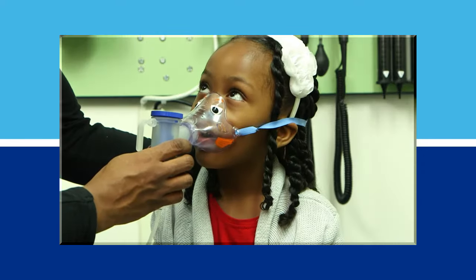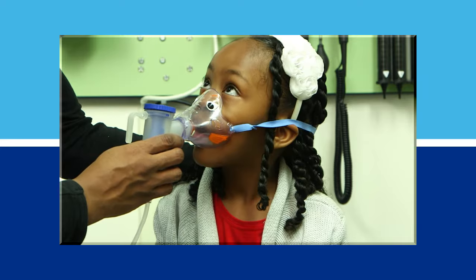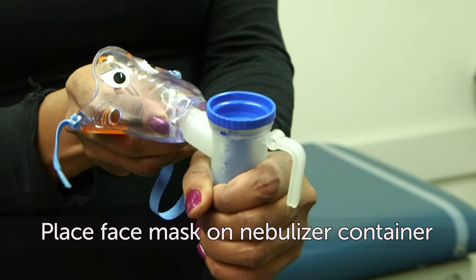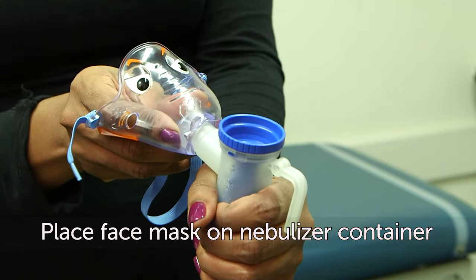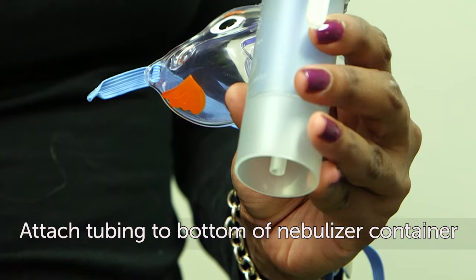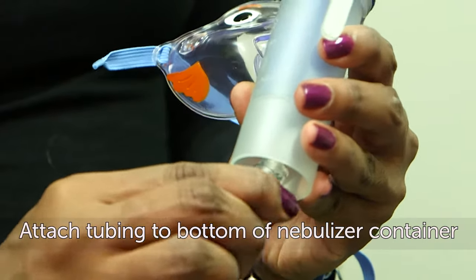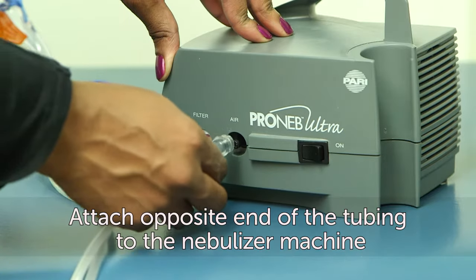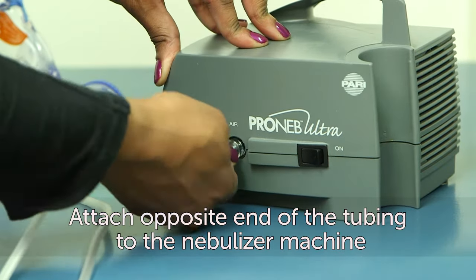For the best results using a nebulizer with a face mask, follow these steps. First, wash your hands thoroughly. Next, place the face mask on the nebulizer container. Then attach one end of the tubing to the bottom of the nebulizer container, and attach the other end of the tubing to the nebulizer machine.